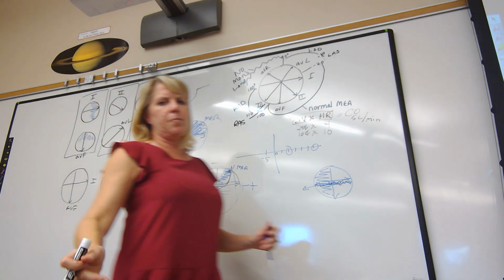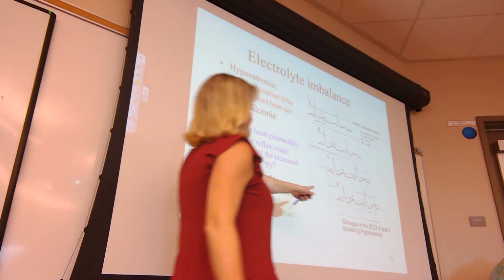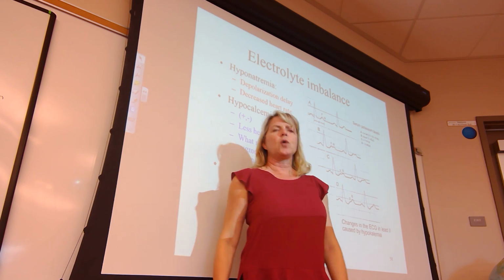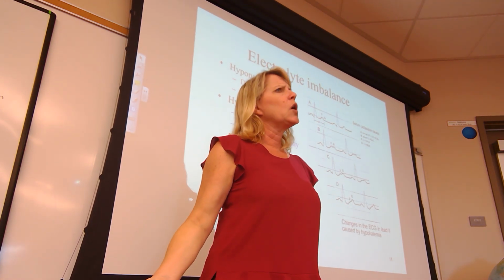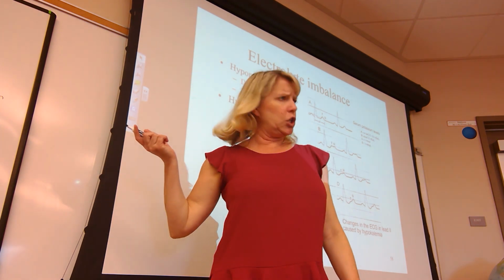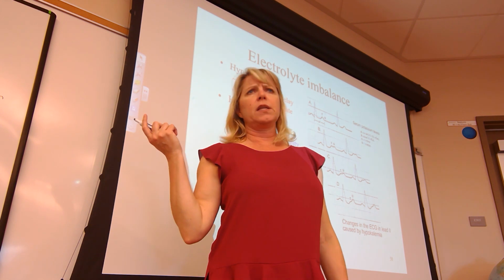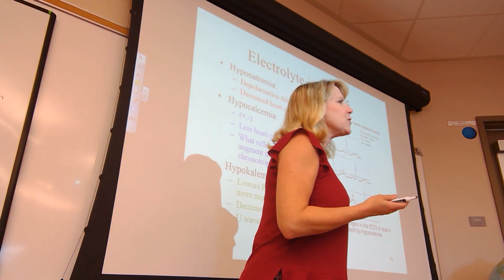You actually see the pen going up. And students say, what the duck? Why then do we call it U? It's not going down like a U would go down. It's not the shape of the letter U. It's because U is the letter after T.